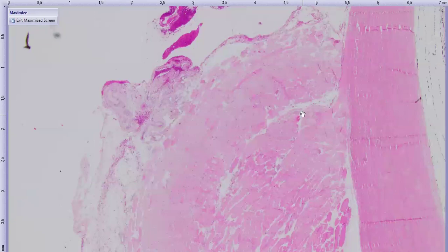There have been some horses with complications down the road, at least with an initial debulk, and there's spotty history in terms of actually doing necropsies and all sorts of things. So it's a small case number. While there's maybe some evidence that it could be slow growing with a relatively good prognosis, I'd say just be cautious because it's still small case numbers. And I can't find the sarcocystis, but it's not a big deal.